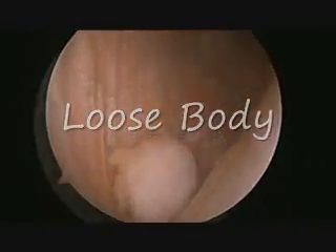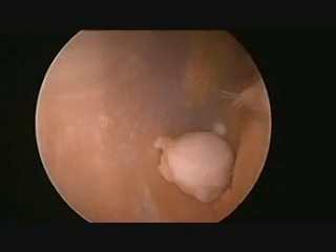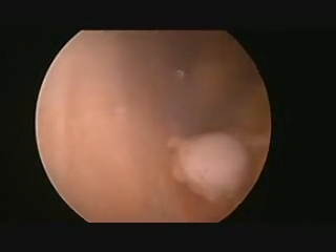This view clearly shows the location and size of the loose body. Fingertip pressure from the outside of the knee can be used to move the loose body into an easier location for removal.